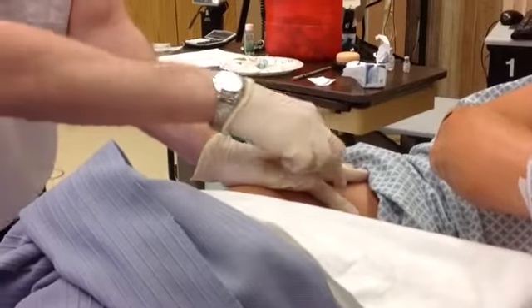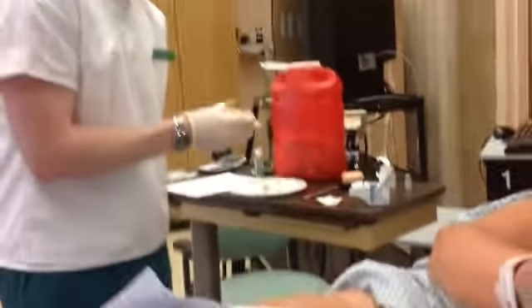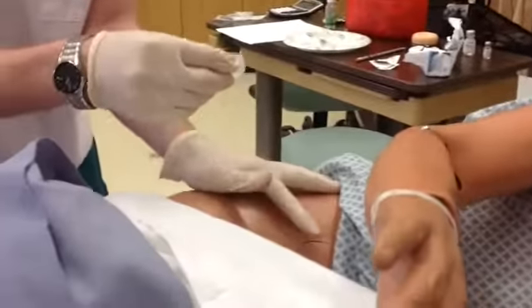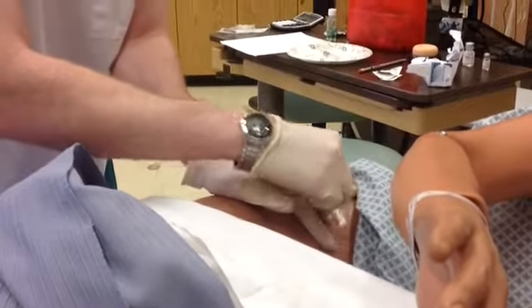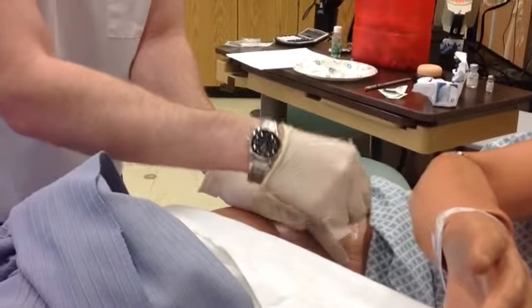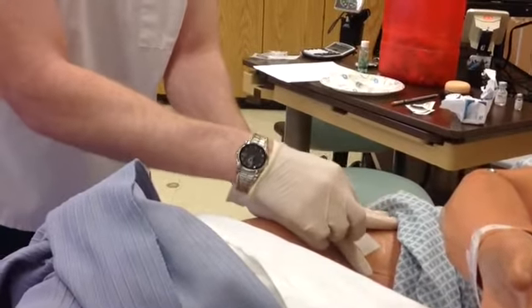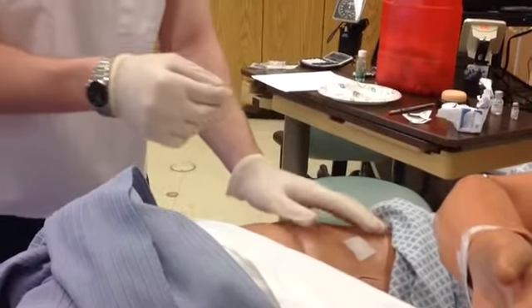So this is going to be my site, so I'm going to give a quick wipe with my alcohol swab, find my site again, and I will leave the alcohol swab here, pointing towards where I need to give my injection.